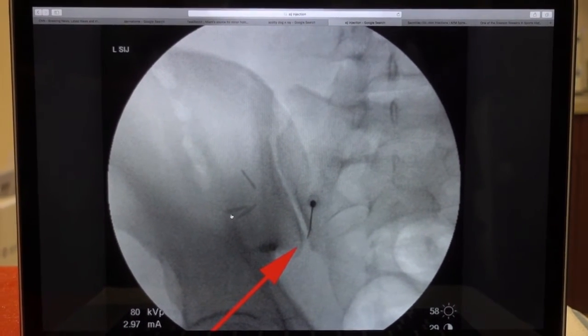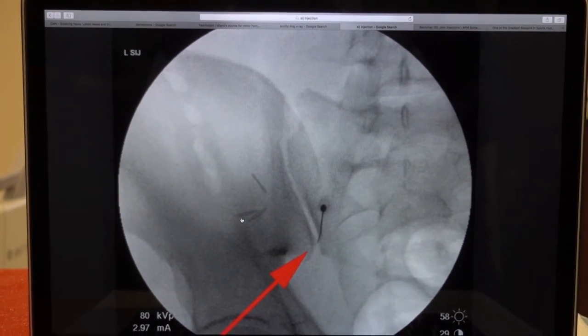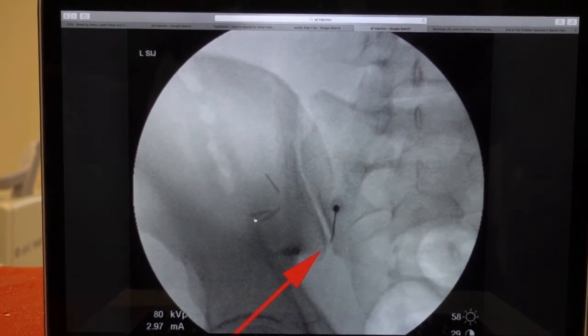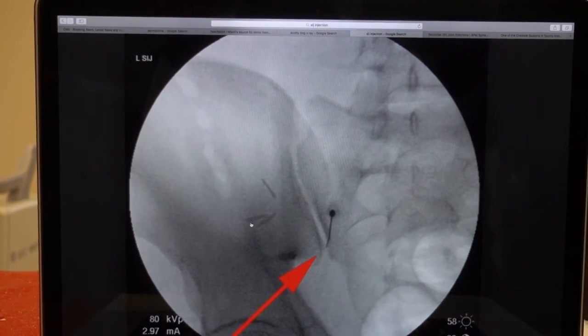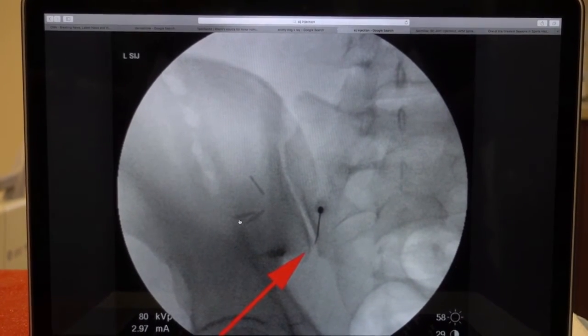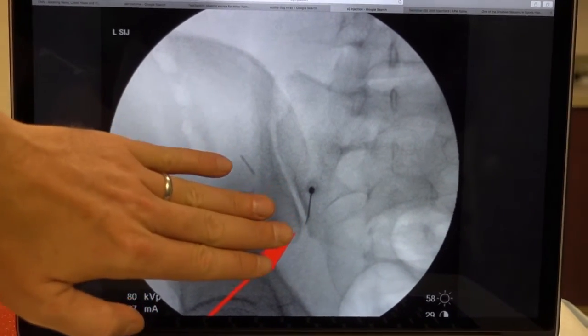A lot of times, and I remember TG had a patient who's like, oh no, don't worry about this, you're going to be fine. But that patient, I remember, looked alarmed. She knew, because we'd done an SI joint injection, there's no way this is an issue at all. We just got to wait. And a lot of times, if you just reassure the patient, then they don't become vasovagal and escalate into something big. But this is the SI joint.